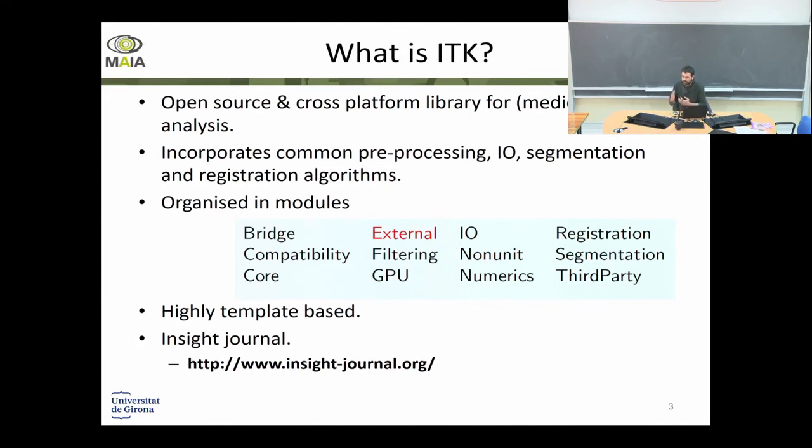The idea is that registration tries to align the images to compensate for spatial differences, to highlight the interesting differences, whether it is an object, or a lesion that has grown, or a lesion that has disappeared, etc. So registration basically compares two or more images in order to analyze the changes in an image. ITK has a lot of registration algorithm implementations as well.